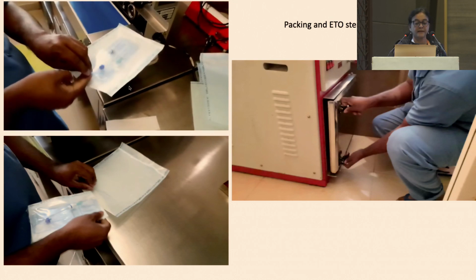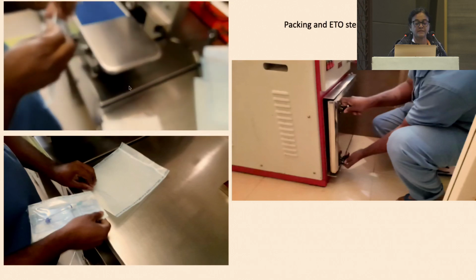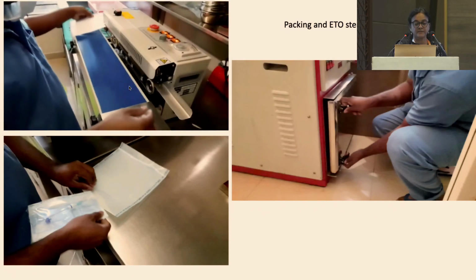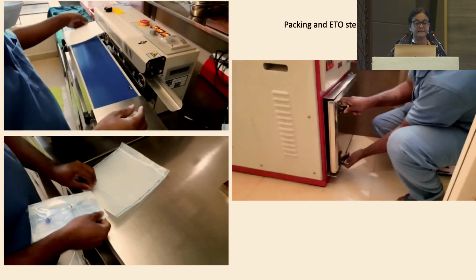This is how the packing is done for the sterilization process. The first pouch is sealed with the cutter and the tubings. So the airtight sealing process has to be foolproof, so double sealing is done.